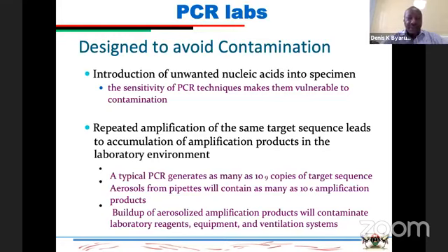Now, PCR labs are mainly designed with the backdrop of avoiding contamination, which is the most critical component when you're setting up PCR facilities, as well as, of course, you don't forget about the considerations for the biosafety. But primarily, you are looking at avoiding contamination, both in processing, but also in the personnel that are working with the PCR samples. And to avoid contamination, you want to ensure that you avoid introduction of unwanted nucleic acids because of the high sensitivity of the PCR technique.